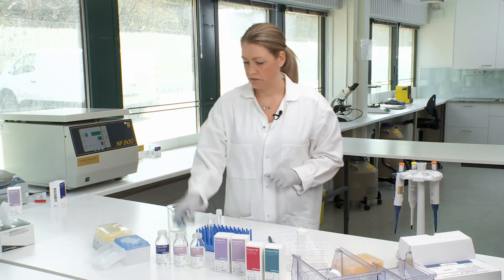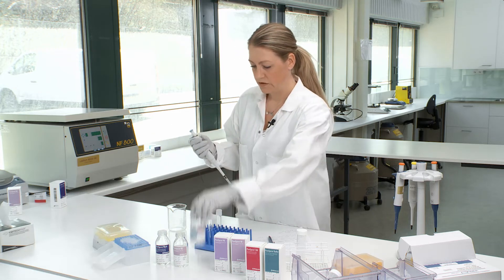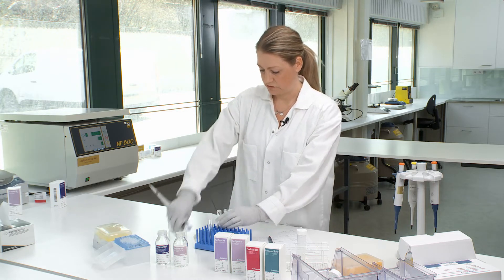Today I will show you the PureSperm 40 and 80. We start by taking the 80 layer and putting two milliliters into our centrifuge tube.